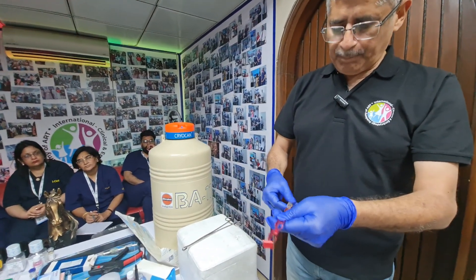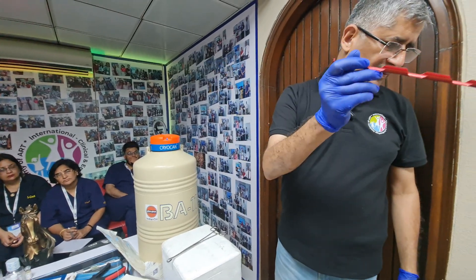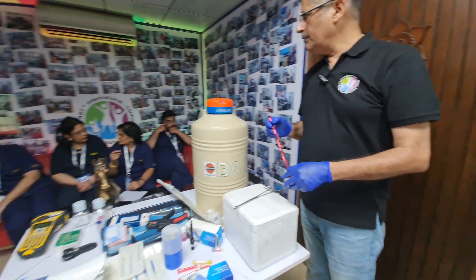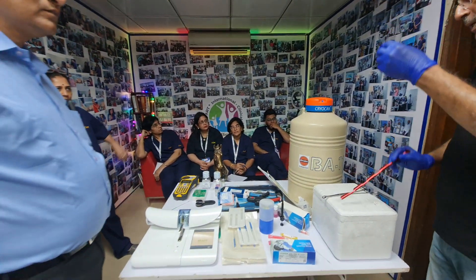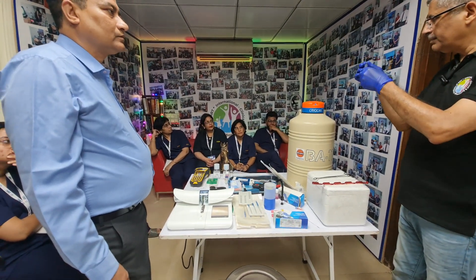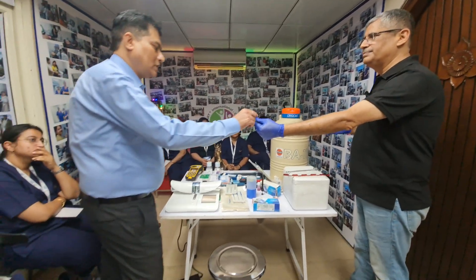For vials, they go into the canes just like this. I'm sure you would have seen videos about this. We don't want the vials with an open cap — we want to seal the caps.